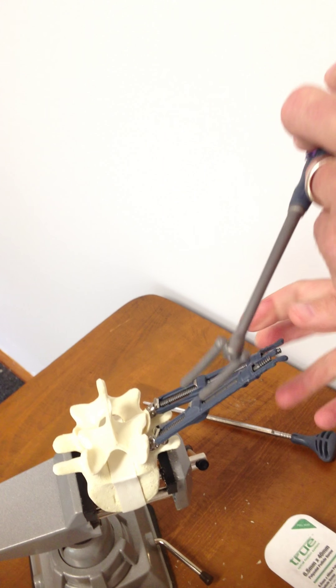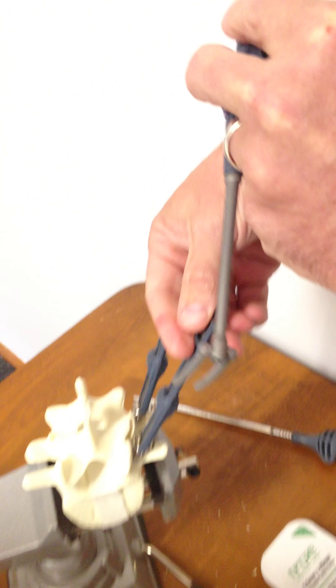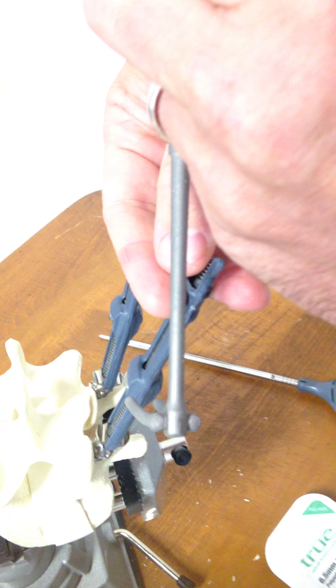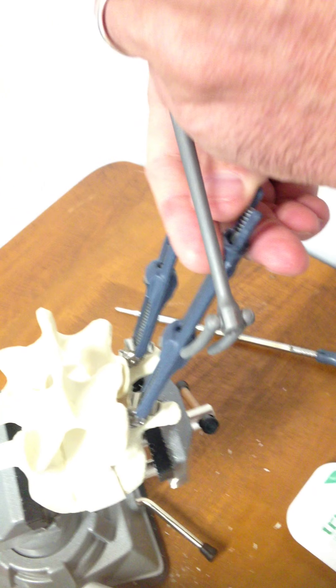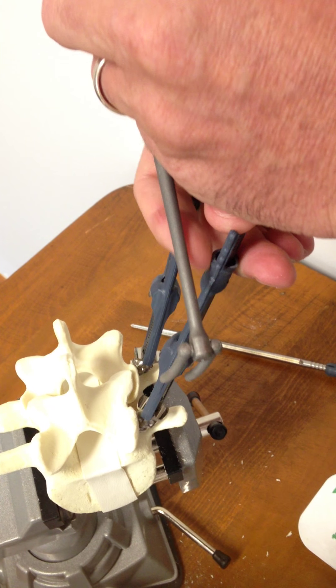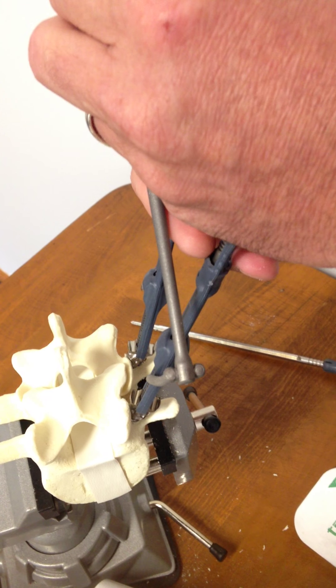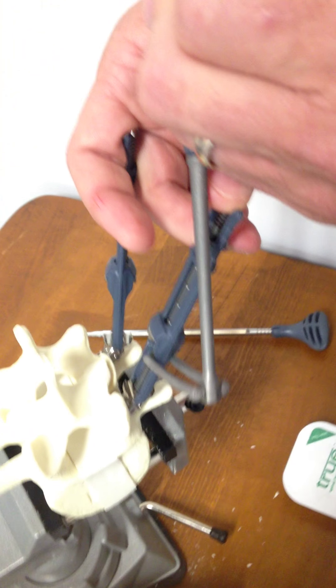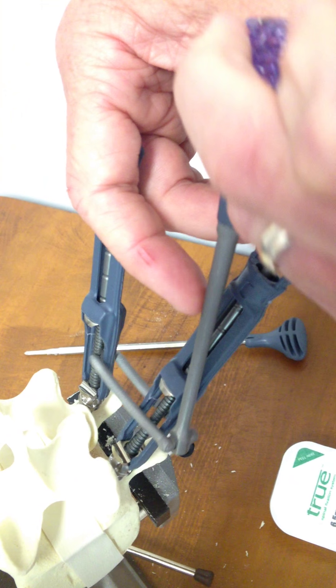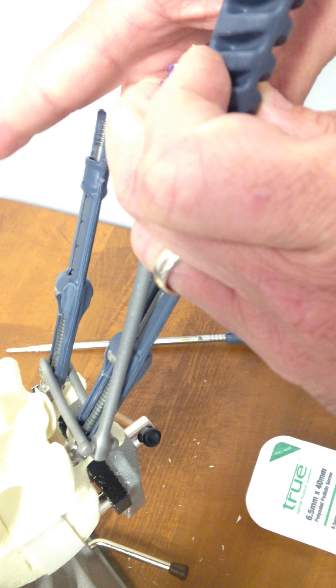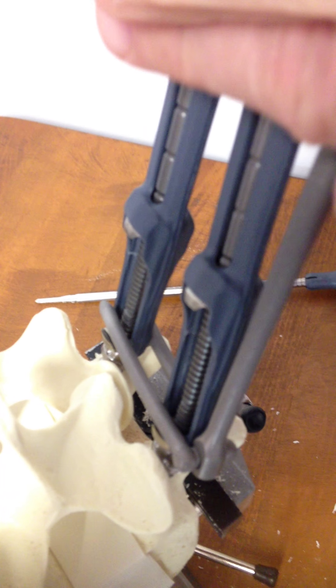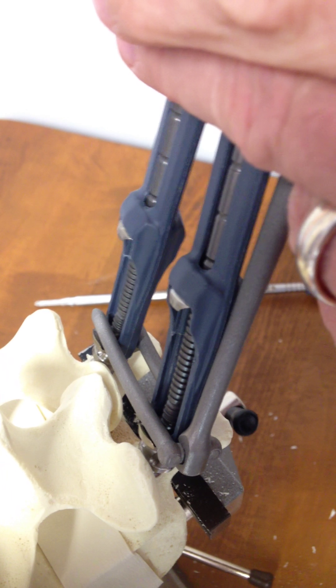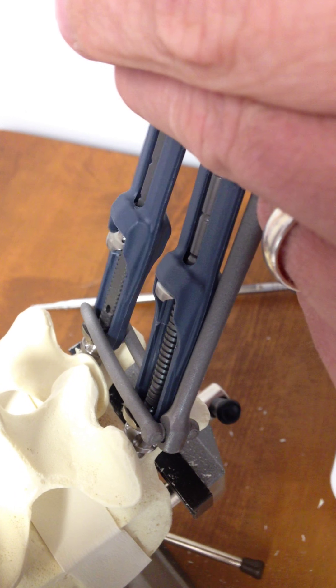And then rod delivery, very similar to other systems on the market, using similar motion of bringing the rod down in parallel with the breakaway shaft and then angling that back over, and then bring that down in between the two screw breakaways.